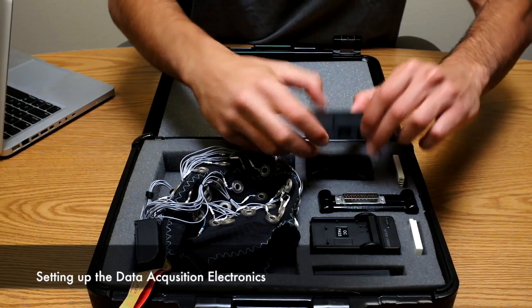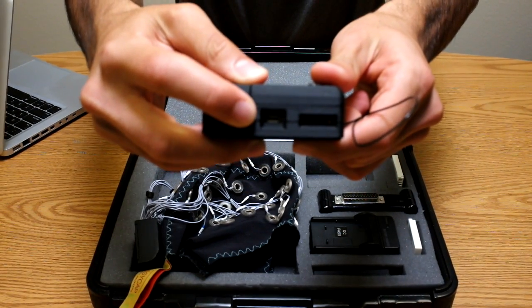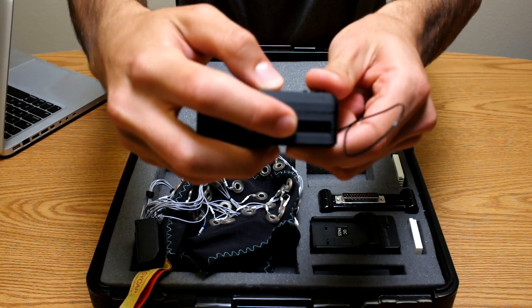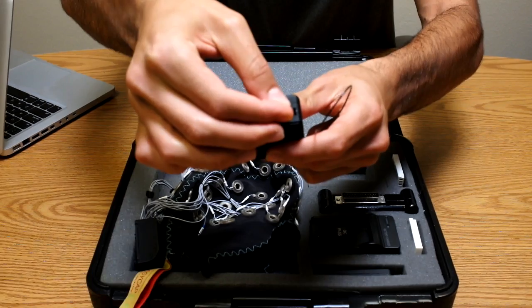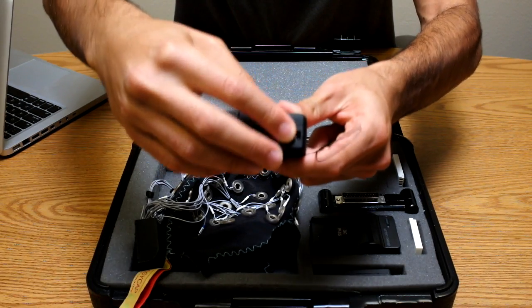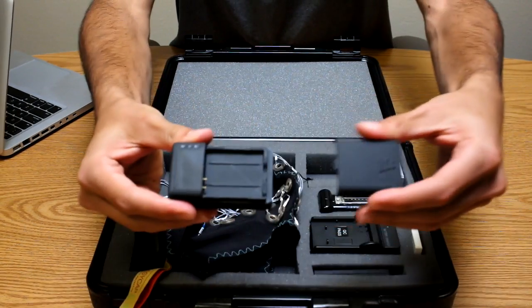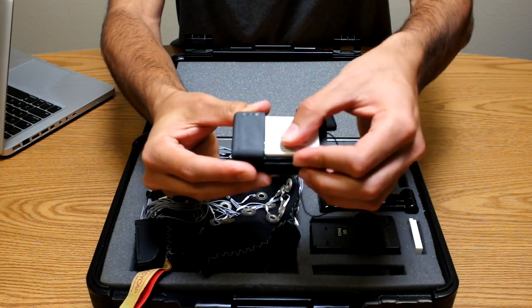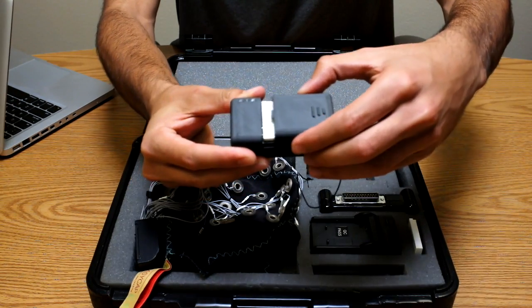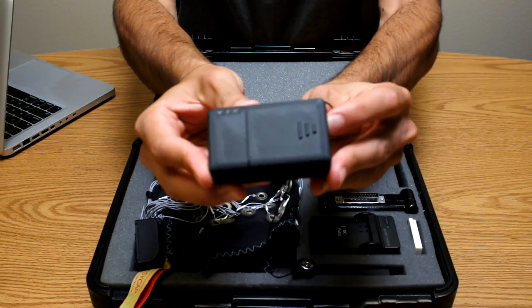To start using the system, first remove the amplifier. The amplifier includes an extension port for external channels and a microSD slot for onboard storage. Slide open the battery compartment and insert the battery. Push the power button to turn the system on.